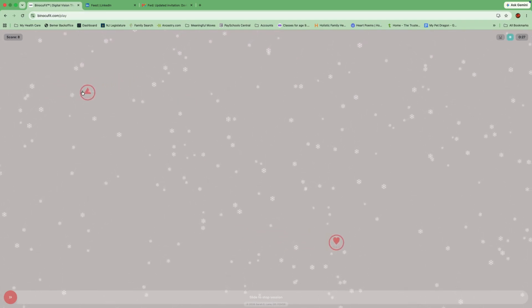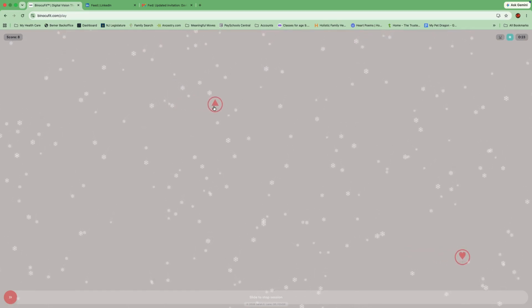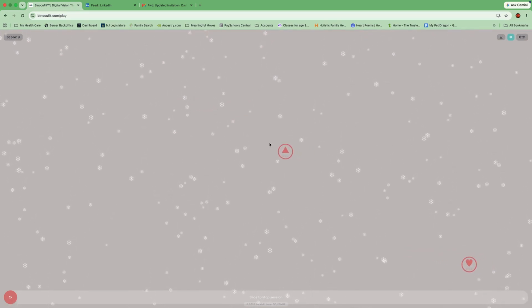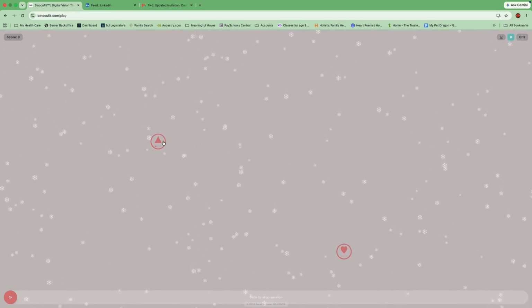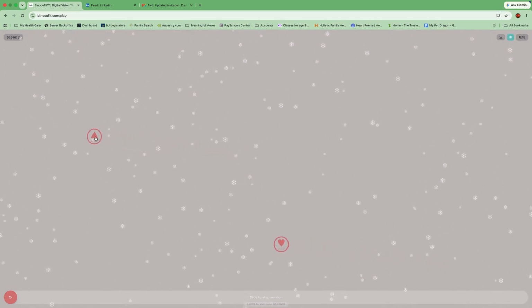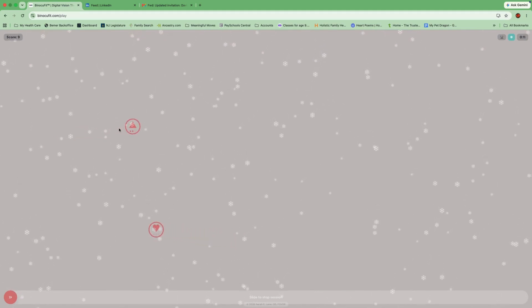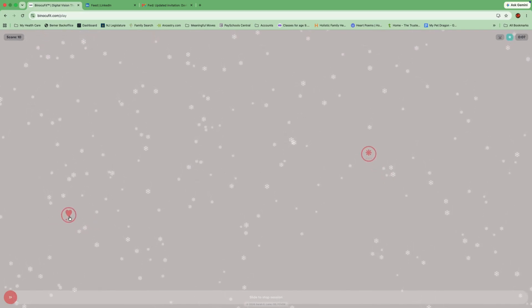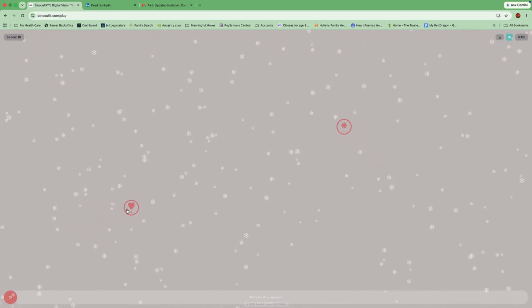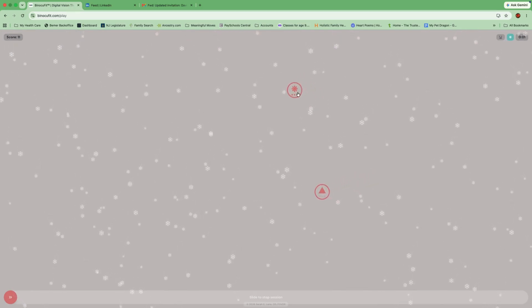So when I use this with patients, I am asking them to tell me the name of the symbol that is inside the shape. So we get a little bit of that verbalization there and an identification, but we are tracking and trying to accurately tap on where it is. Now this one I've chosen only red, so this one's going to be seen by the eye under the green lens. So this is helpful in an amblyopic patient or somebody with a strabismus where we're trying to emphasize information to the eye under the green lens.